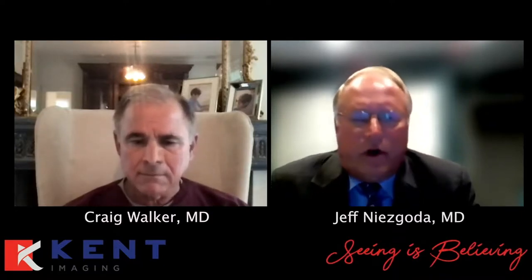But I've been very impressed with, I showed an image with the patient with frostbite in the presentation. It's very difficult to look at. That patient wasn't so tough because you could see some changes afterward, but most of these wounds you put in the chamber and you see nothing going on visually for treatments on end, several weeks before you start seeing that granulation turn around. And what I have found is we can actually take a pre and post snapshot and look at the delta, the change in the StO2 between pre and post. And what may not be visually striking or visually apparent on the camera is very evident that there's a delta there, that we've made a difference.